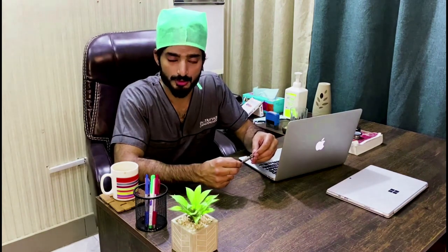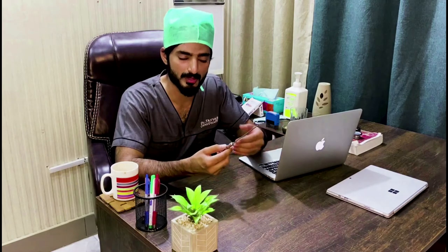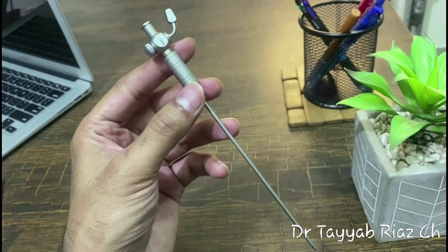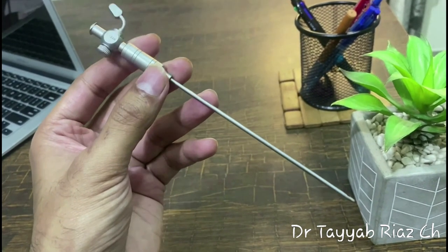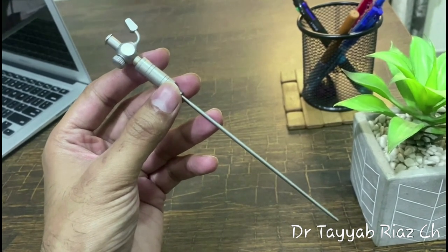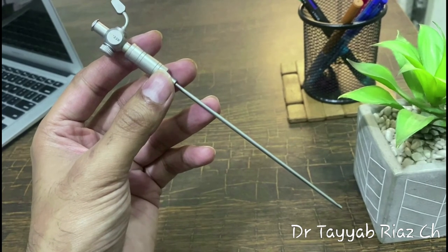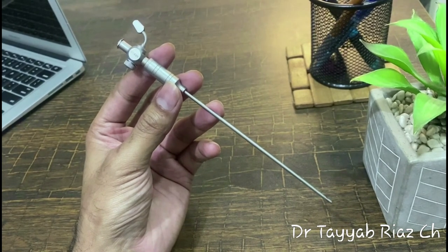Now I will show you in close-up the different parts of the Veress needle, how the different parts of this needle work, and I will also tell you the logic behind the working of this Veress needle. The Veress needle comes in three lengths: 8 cm, which is for pediatric patients, 12 cm, which is for adults having normal physique, and 18 cm, which is for obese patients and patients who are undergoing bariatric surgery. But the diameter of all these three lengths is the same, and that is 2 mm.